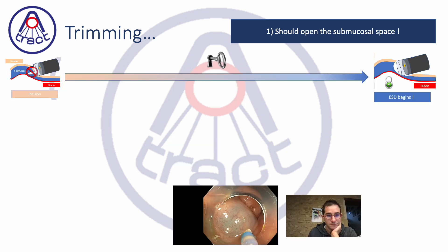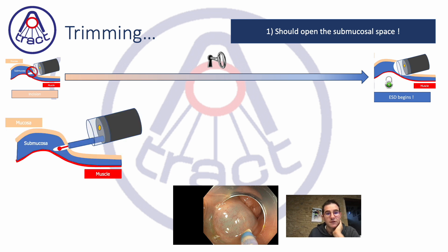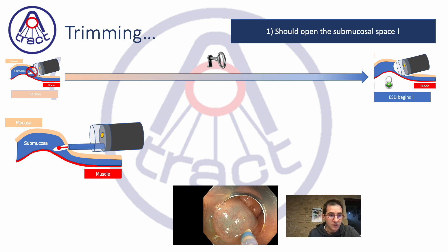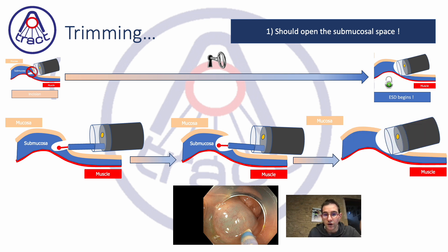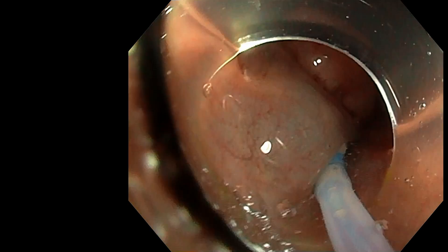Trimming is the important point that makes the space open. When you do your incision, your needle is 0.4 millimeters, so the space is very small. You will change the axis of your knife to cut the first submucosal fibers, open the submucosa, and therefore separate the two mucosal edges. By improving the space repeatedly, it opens progressively and your scope will be able to enter the submucosa. Here is an example of trimming with a dual knife.